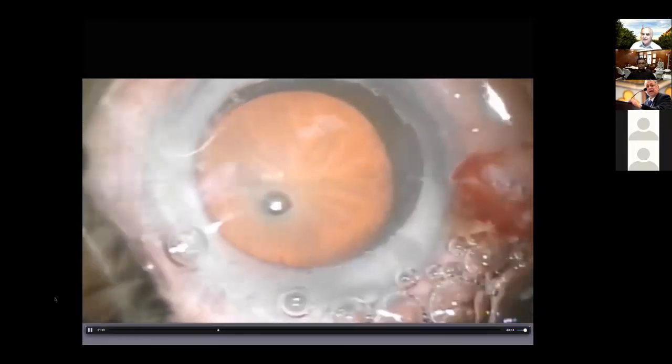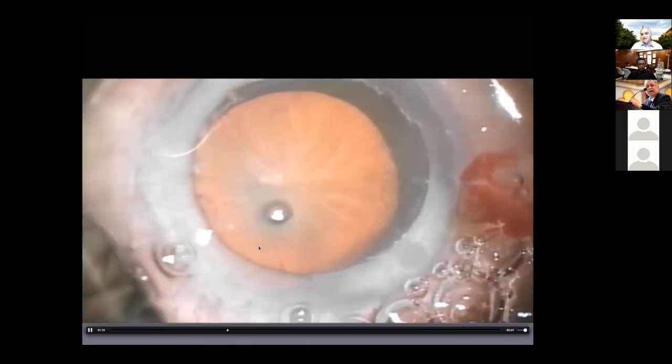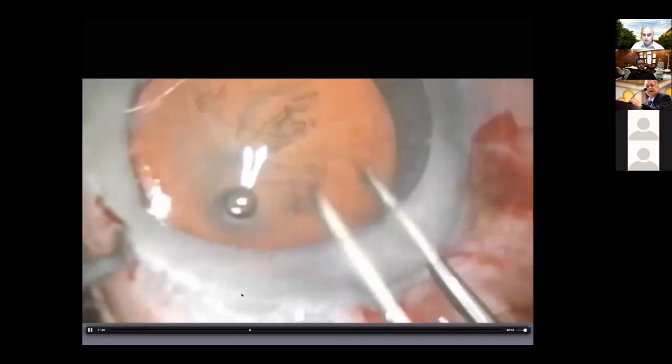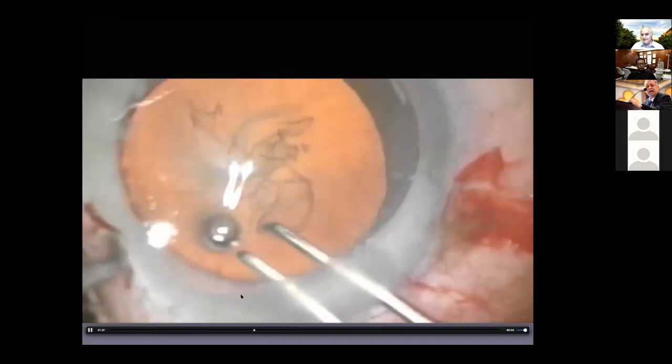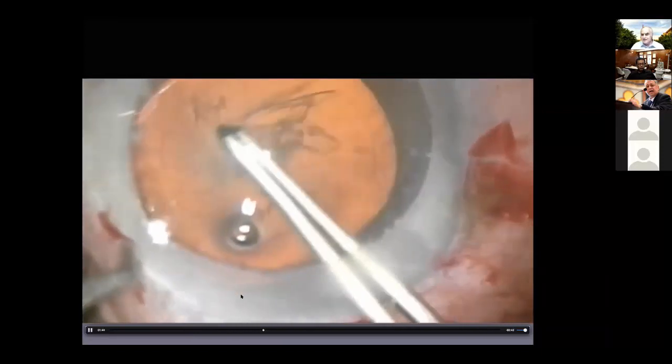it's definitely better. And here I'm showing you, now I only have Descemet's membrane and Dua's layer, and visualization is completely normal, perfect. And the interesting thing is that Dua's layer and Descemet's membrane will tolerate the high pressure that we have during phacoemulsification. So I'm just showing that now you converted the case from a difficult case of visualization to a completely nice, regular cataract case. And not to waste time, I'm doing the regular technique, hydrosection, and then phaco chopping. Everything as normal, the settings are normal.